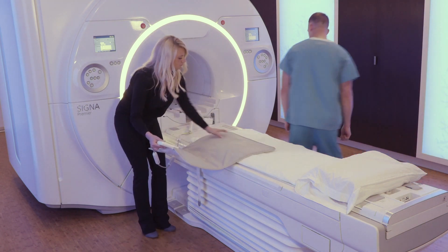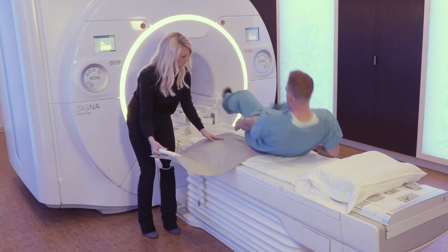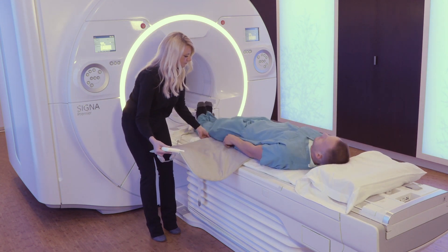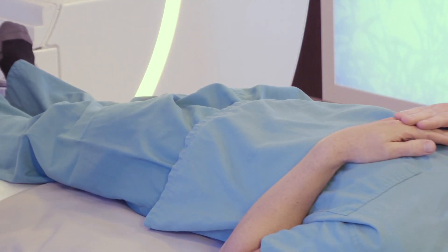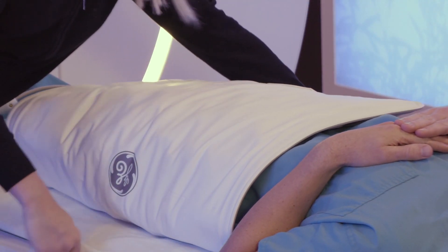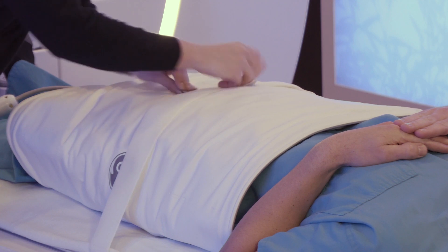To position the patient for a unilateral hip, place the Air Technology AA Coil partially under the patient while wrapping the remainder of the coil around the pelvic region. Secure the coil with the strap.